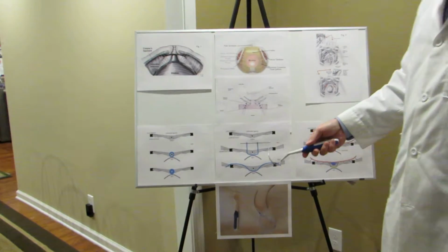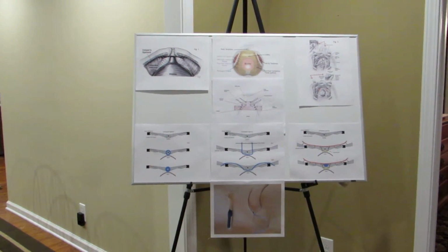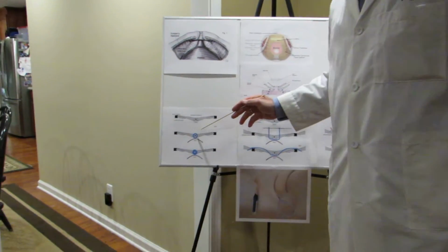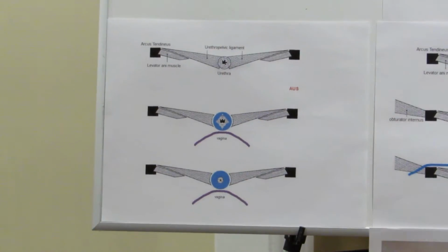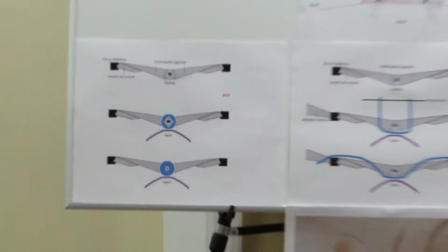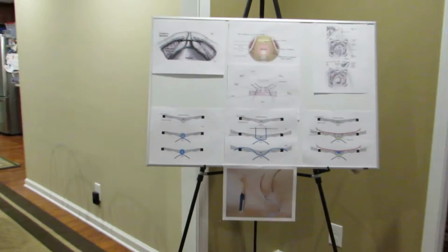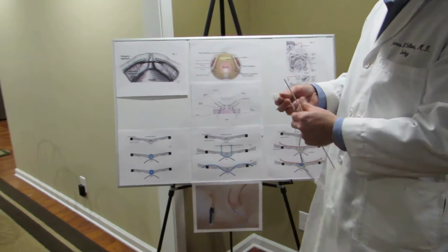When these fail, or the patient had sustained multiple surgeries and loss of tissue and had a more severe incontinence, an artificial urinary sphincter device can be placed here. This again is the vagina, and this is an artificial urinary sphincter. This is a more substantial surgery, which had a lot of complications. It's not FDA approved, but it works better in men.